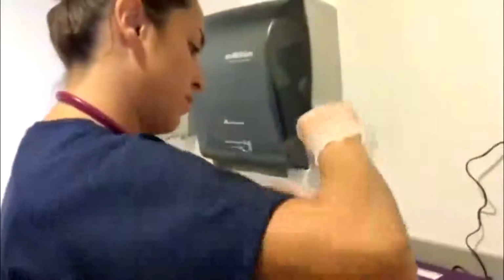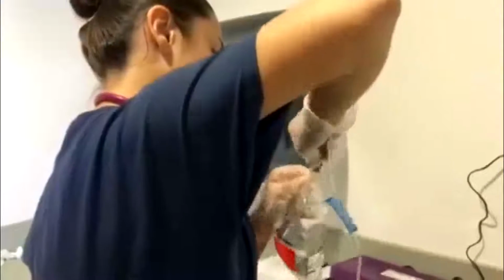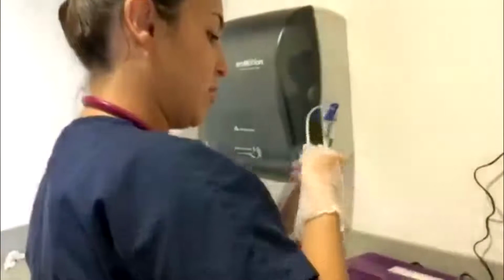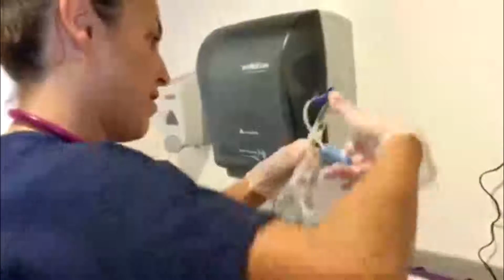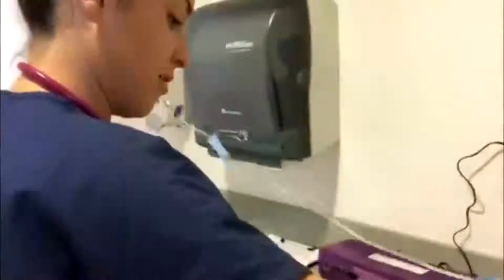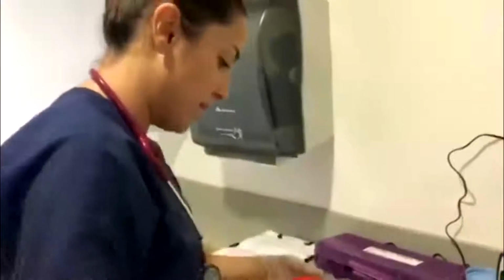And perform a twisting, turning motion. Make sure that it's clamped. Alright. And I can also begin to prime it here before I take it into my patient's room. So I can prime it in my patient's room.